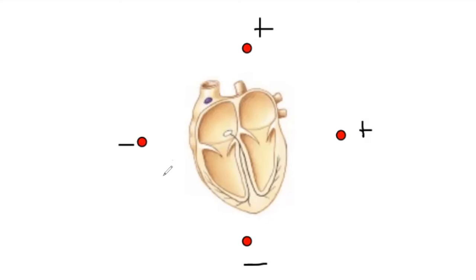Mm-hmm. And then what are our pairs here, or how are we hooking up? So how many measurements are we making right now? How many measurements do you want to make? We're probably gonna go with simplicity. Let's just do 2. So left and right are a pair, top and bottom are a pair. All right. So we'll call this pair number 1. We'll call this pair number 2. Everybody on board with those conventions?